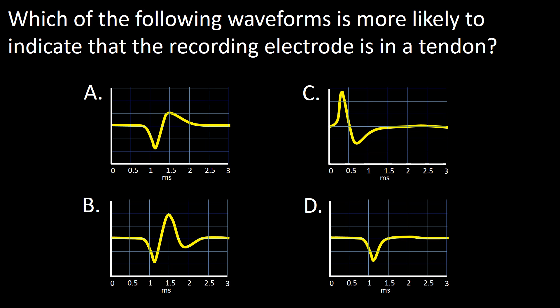EMG question of the day. Which of the following waveforms is more likely to indicate that the recording electrode is in a tendon? Please look at the four figures and choose the correct answer: A, B, C, or D.